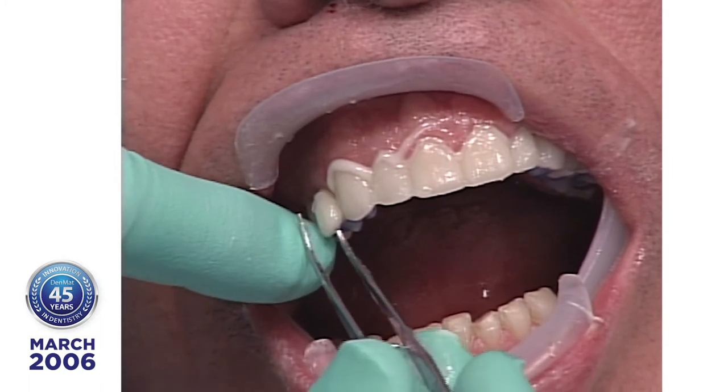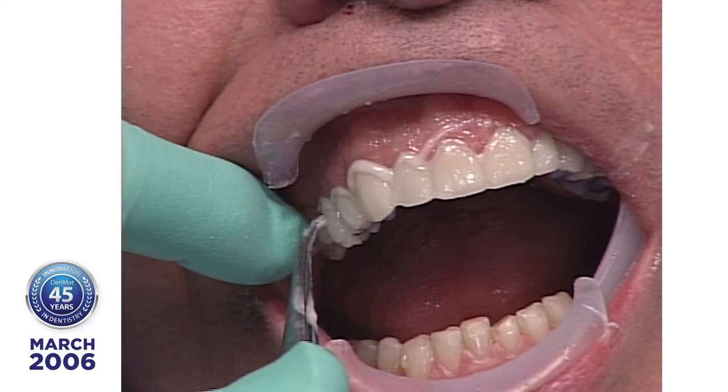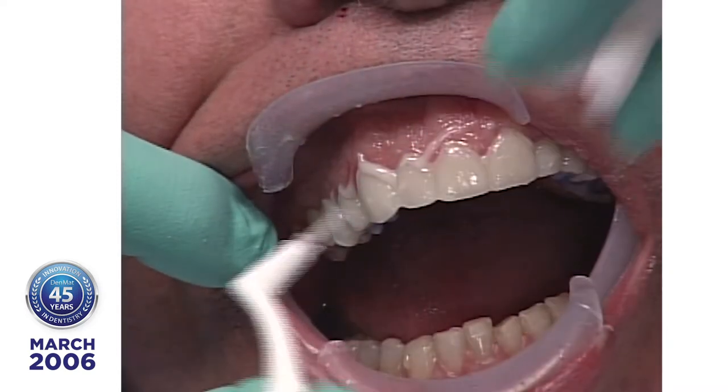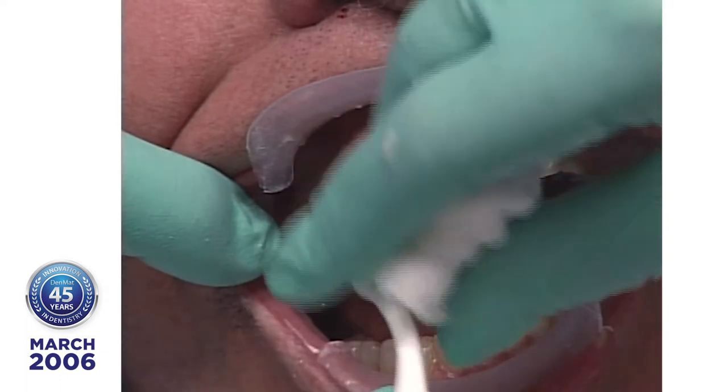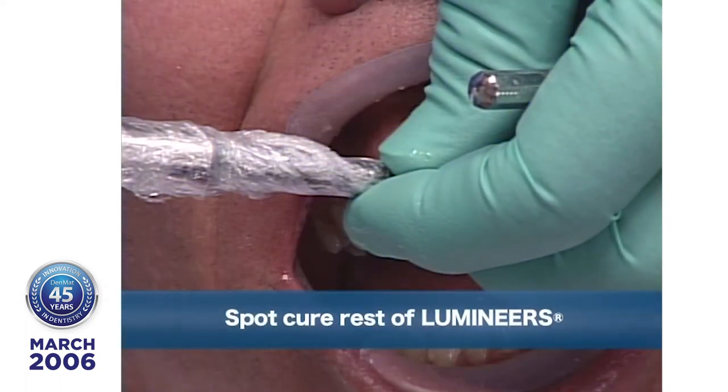Guess what? We're putting a veneer over what? A porcelain crown. No big deal. The veneer doesn't know it's a porcelain crown. It doesn't know if it's enamel. Close your eyes.